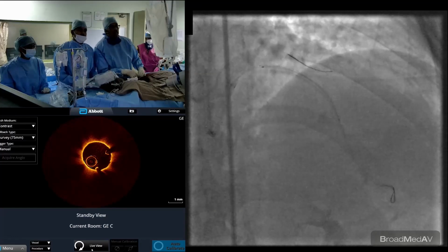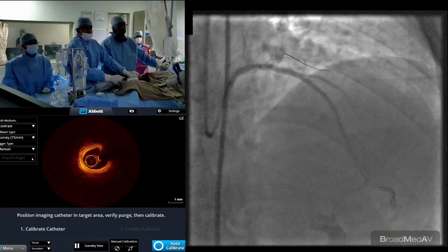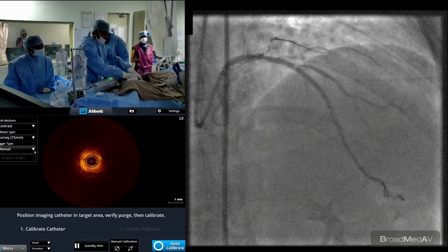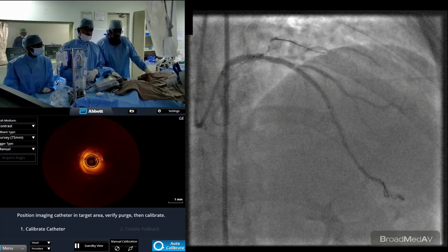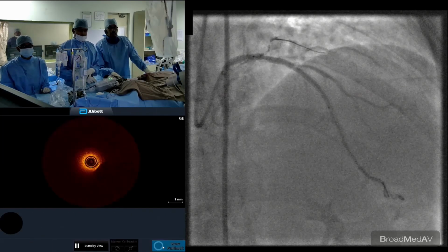Okay. Yeah, we are beyond the stent, the distal now. No, flush the guiding please first. And we hope we can do that. Yeah, now open the injector port. Okay, everybody ready? Port is ready, dye is ready, pressure injector is on. Calibrate. Yes. Cine.